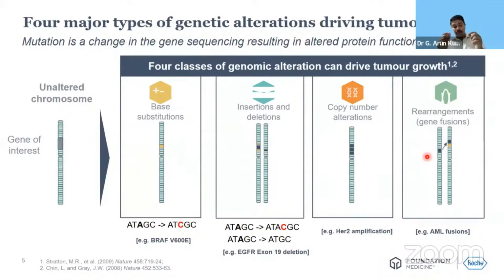So a point to be noted is not all rearrangements actually cause a gene fusion. There could be rearrangements where the gene is cut, but it is not pasted with another gene, so you don't get a gene fusion event happening.